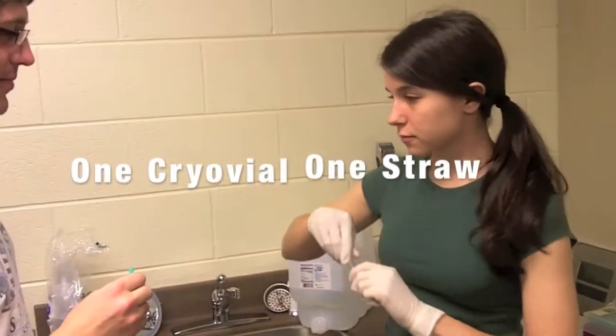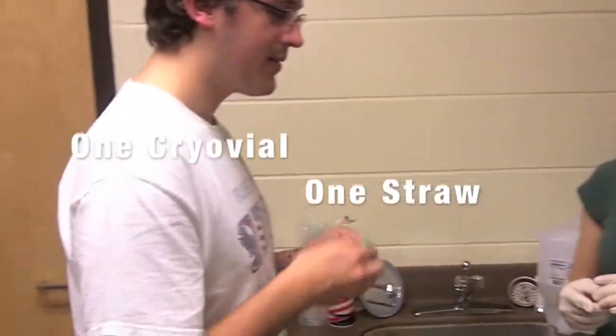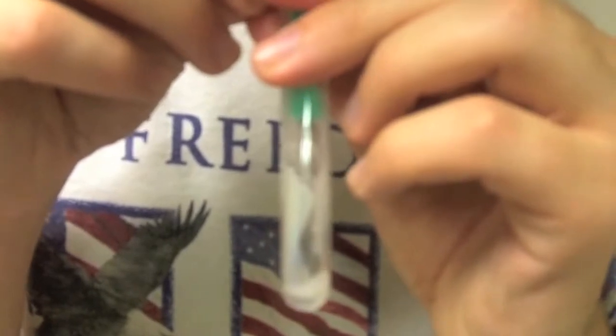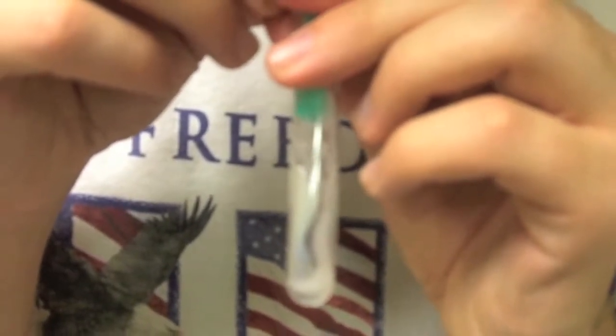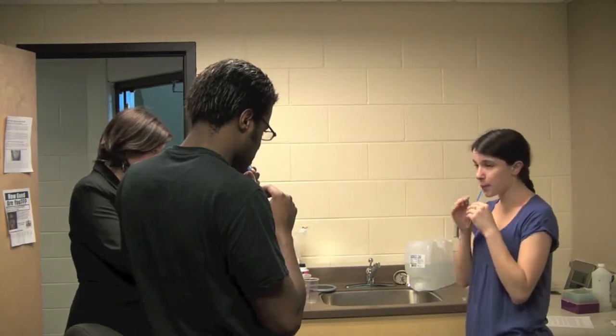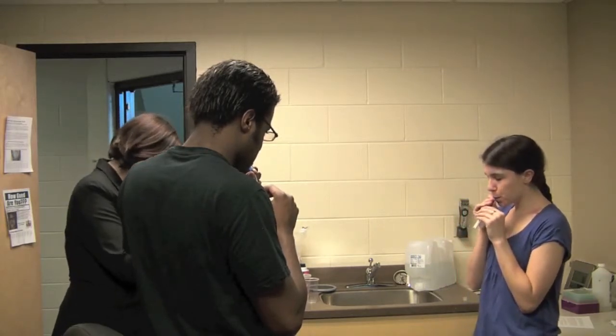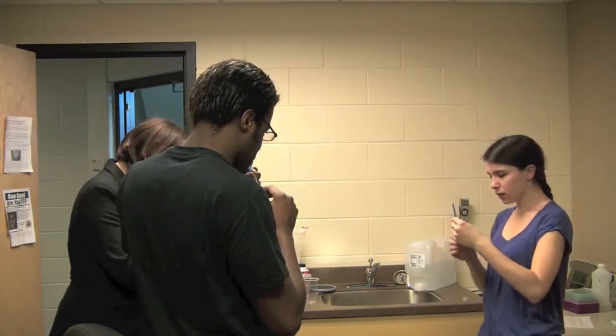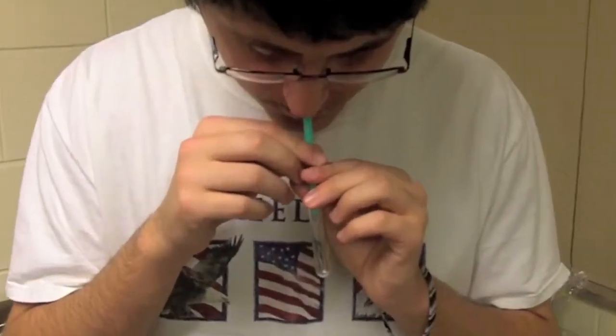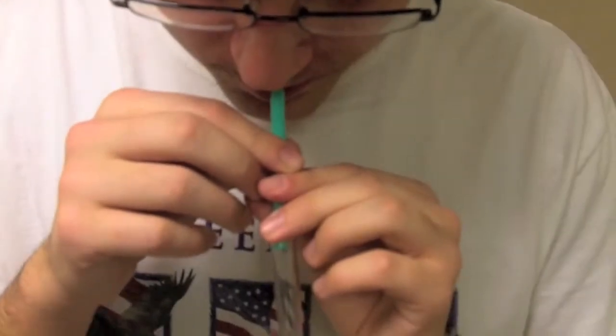How to collect saliva: Record the time of day on the label. Instruct the participant to imagine eating their favorite food, allowing saliva to pool in their mouth. With their head tilted forward, the participant should drool down the straw and collect the saliva in the cryovial. Be aware that it is normal for the saliva to foam. Repeat this procedure as often as necessary until a sufficient sample is collected.